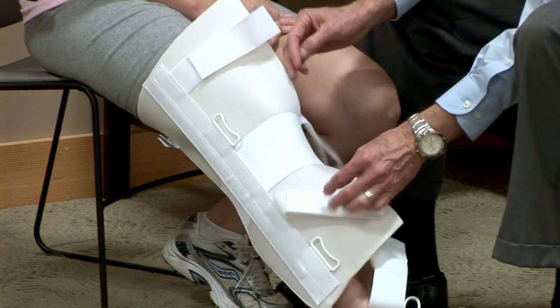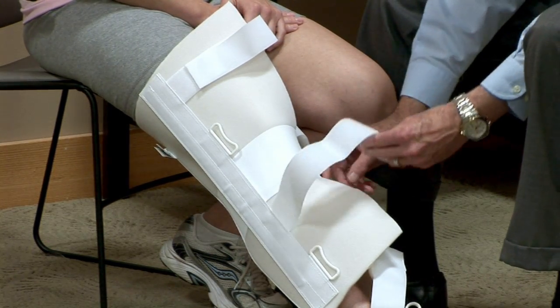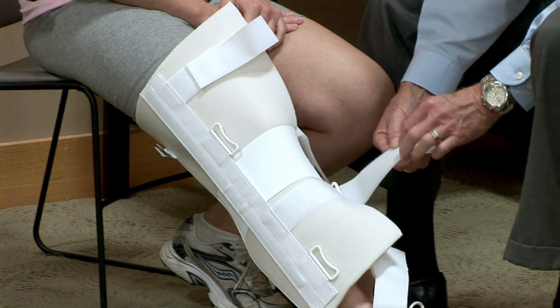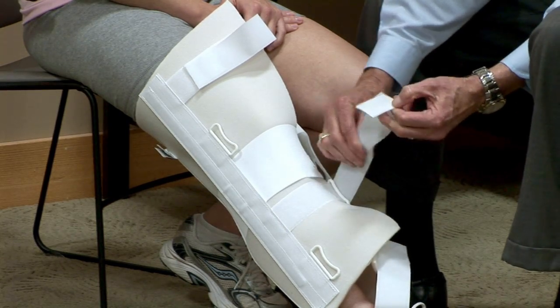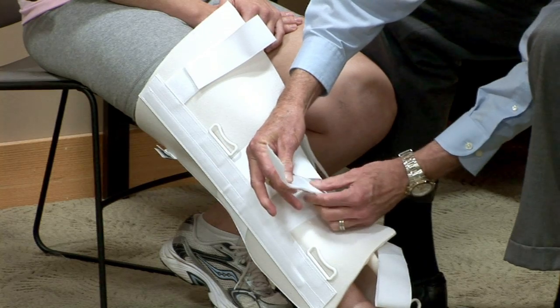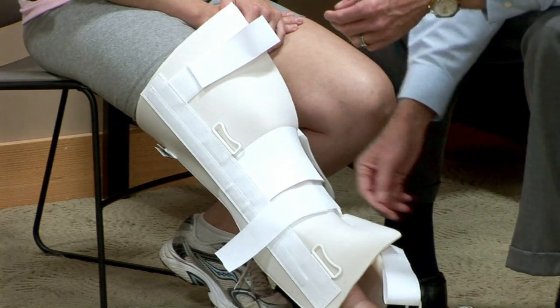Then I can do the Velcro loop and lock closure. These are length-adjustable straps where there's a separate Velcro tab. If you need to, you can set this, set the Velcro hook there, and then trim off the excess. So they're length-adjustable straps.